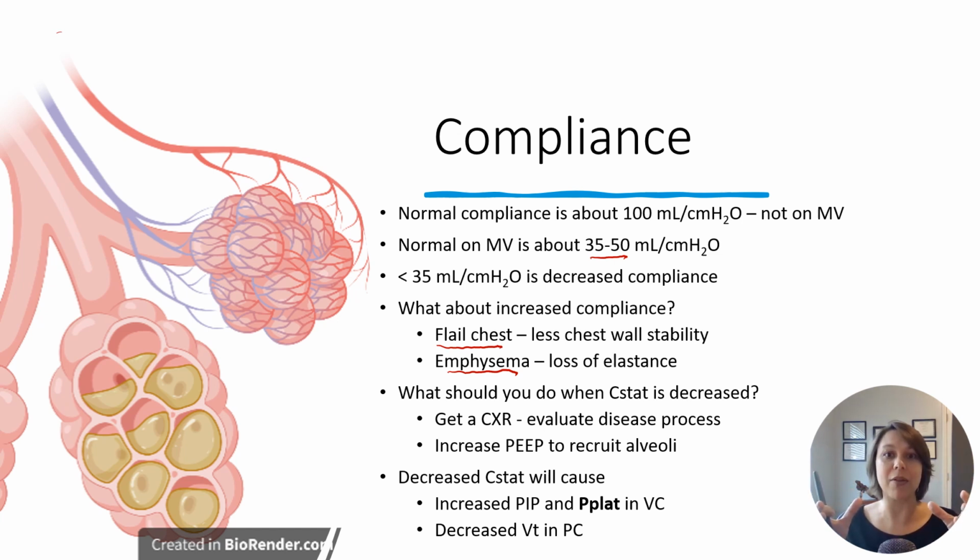You can kind of think about that as a rubber band. We stretch it out, and if we stretch it out too much and we keep stretching it out over time, that rubber band loses its elastance or ability to come back. So without that elastance, we can see an increase in compliance. Sometimes this is a test question about what causes an increase in compliance. Other times emphysema is given as an answer. Make sure that you don't choose it for decreased compliance.